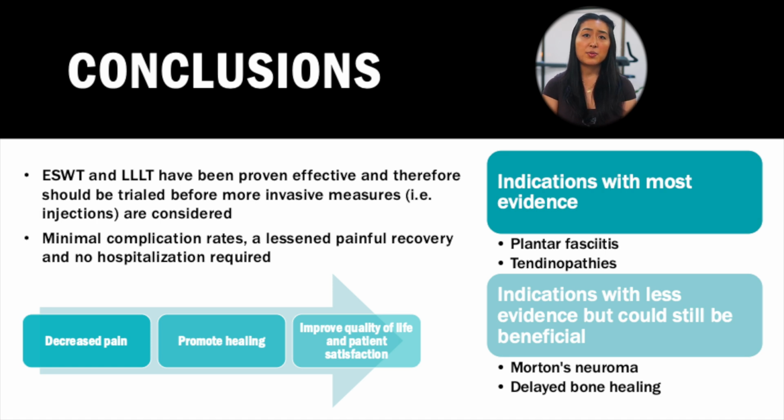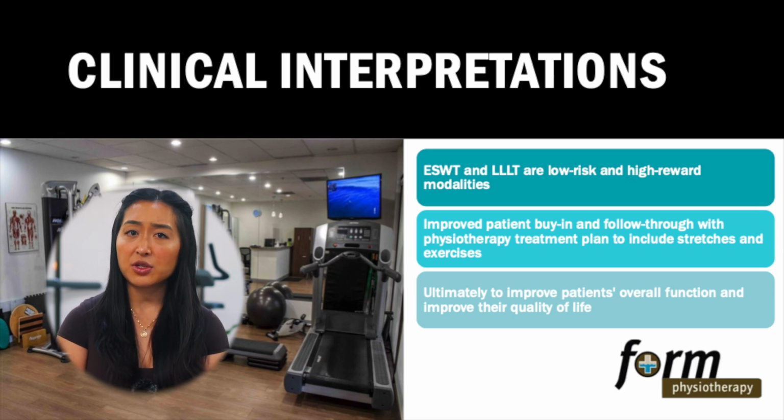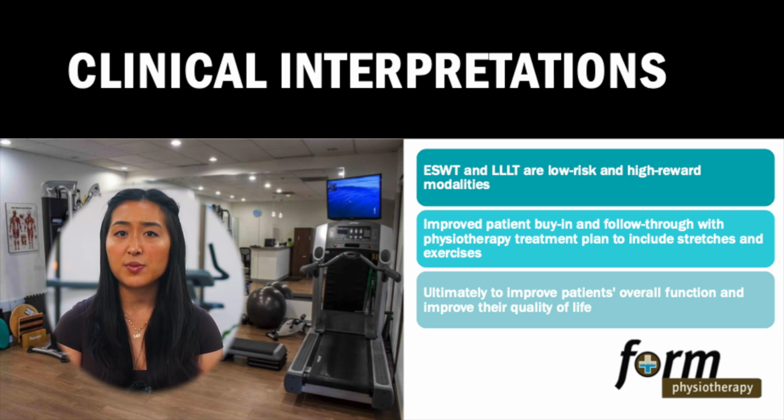Just to reiterate one more time, in terms of patient selection for most positive and successful outcomes, plantar fasciitis does seem to be the pathology with the most scientific backing, followed by tendinopathies like Achilles tendinopathy. I have personally also had good clinical success with treating peroneal tendinopathies and tibialis posterior tendinopathies using shockwave therapy. Lastly, just to put it all together and summarize my presentation today, both shockwave therapy and laser therapy can deliver quite impressive results, with them both being low-risk modalities.